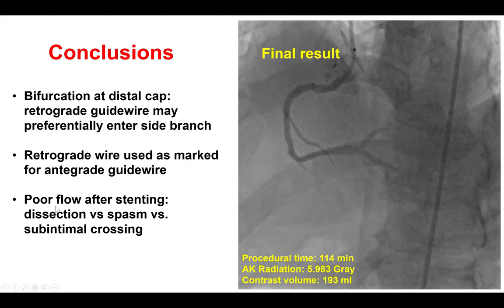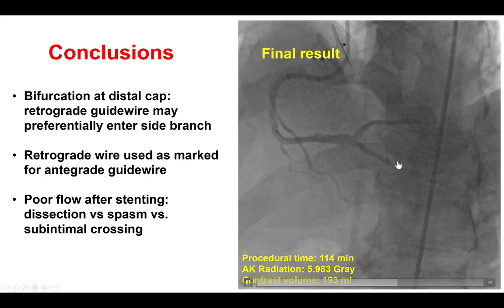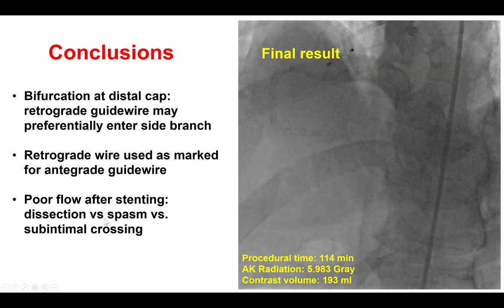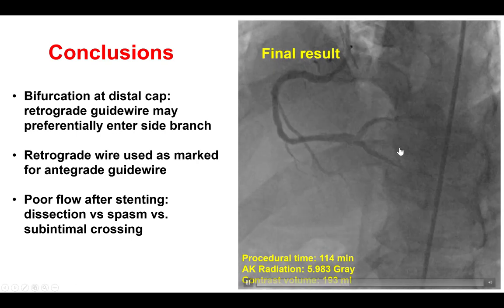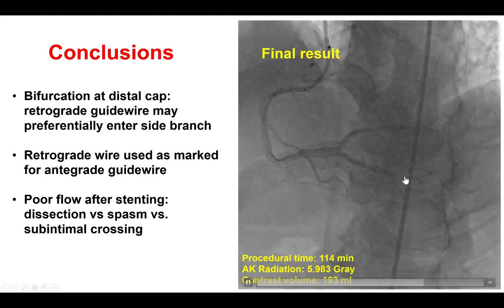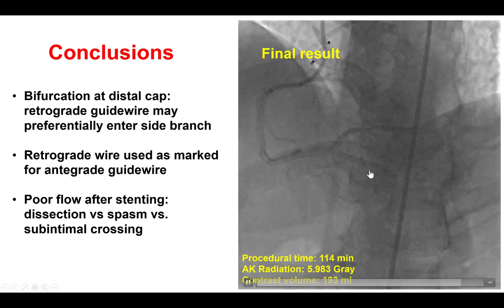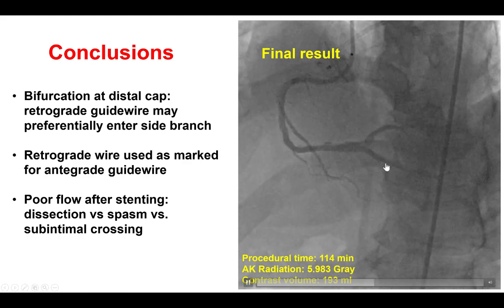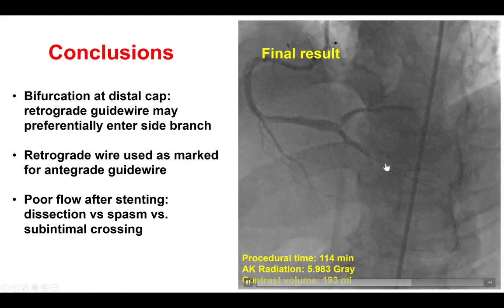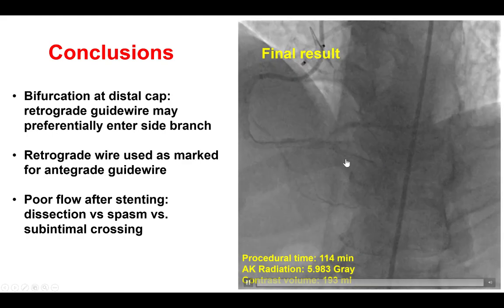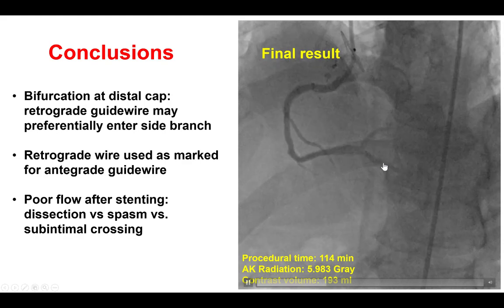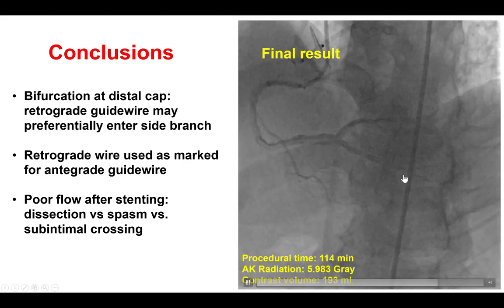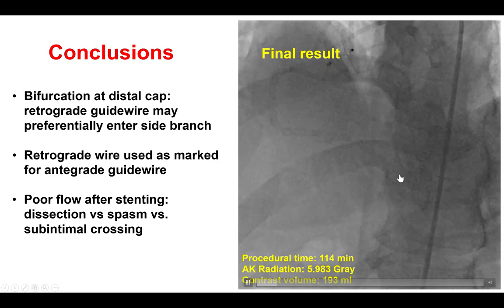We also found that there was poor flow after stenting and there was always the question whether there is spasm, dissection, or a true lumen issue distally. We did know that we went retrograde into the true lumen in the RCA from the intravascular ultrasound, and that is why we needed to place two additional stents that did restore TIMI 3 flow to the PDA. Thank you very much.